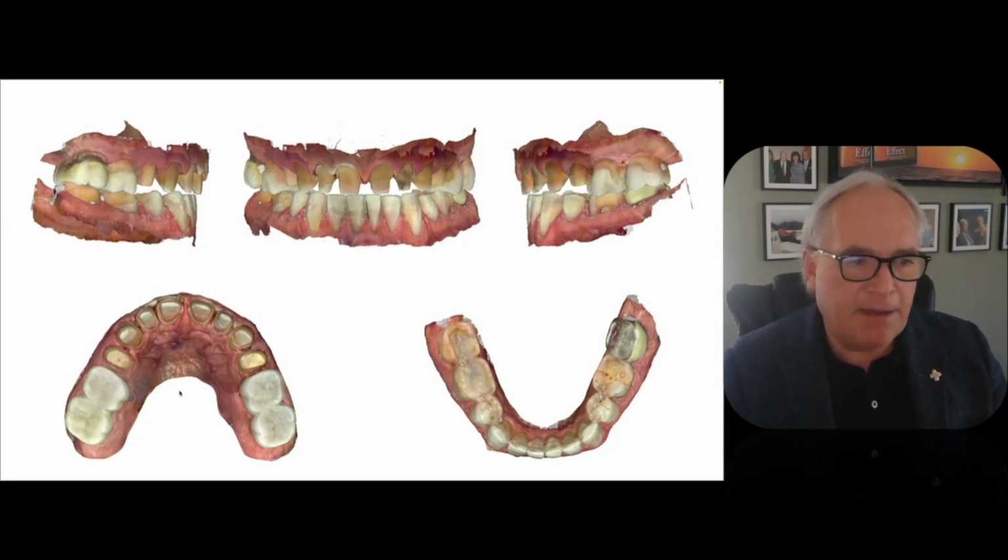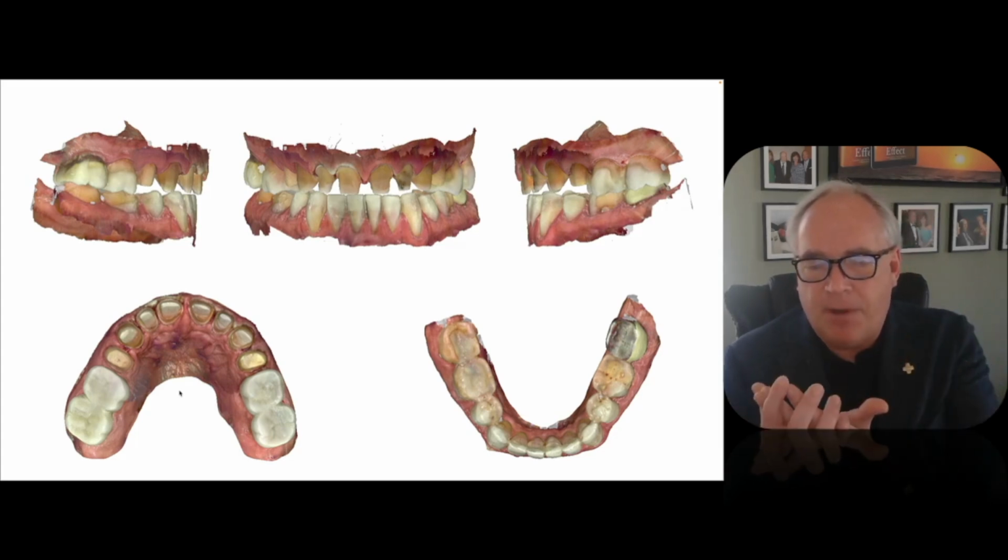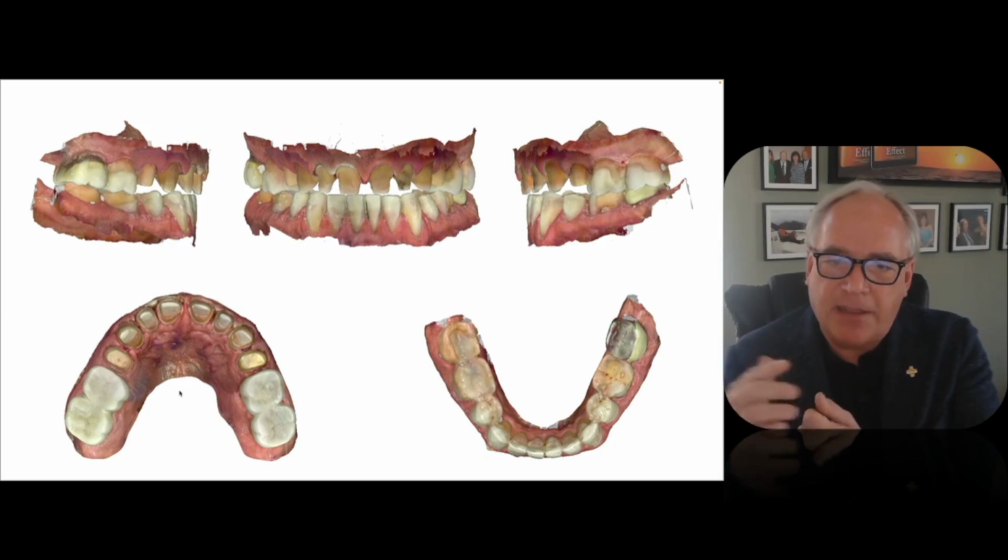And what we did to print it, and this will be something that we'll certainly talk about in more detail when Lee's here, is when we send the scan to Lee, he will also have the file for my design that we did. And he has the capacity, in about 20, 25 minutes, to take my wax up and superimpose it over the preps and connect the margins.